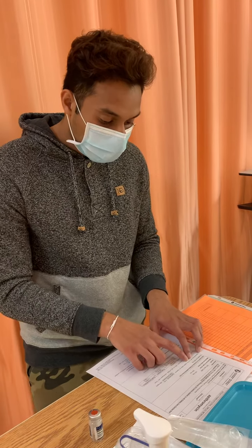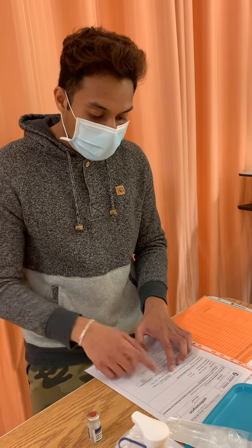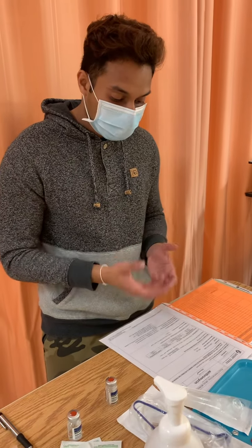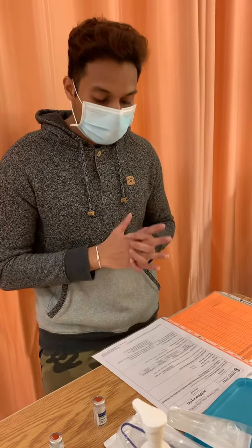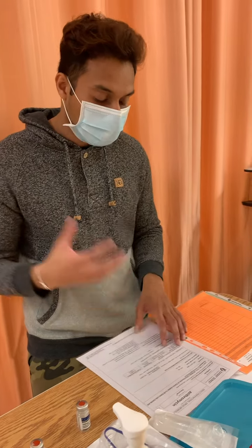So reconstituting with 4.8 ml of sterile water, injecting it in, gives a final volume of 5 ml and a final concentration of 100 milligrams per ml in this vial. For the IV intermittent, we're diluting in 250 ml to 500 ml of normal saline. We checked previously that the primary is running on normal saline. They're both compatible with each other, so we don't have to worry about that. And they're both isotonic, so not going to cause any problems with the blood.